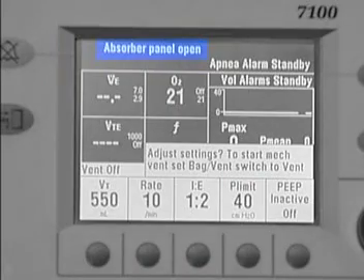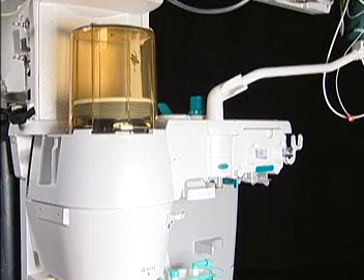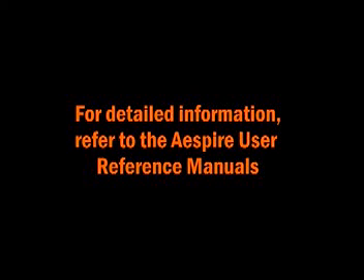Note: if the ABS is not fully engaged, the absorber panel open message will appear on the 7100 ventilator display. Be sure to conduct the leak test outlined in your user reference manual following the removal and replacement of the ABS.